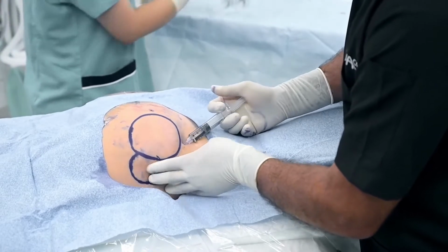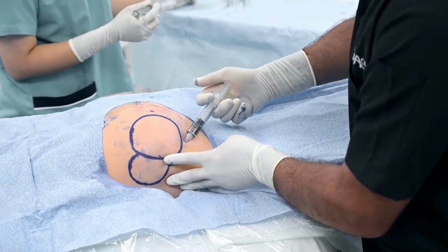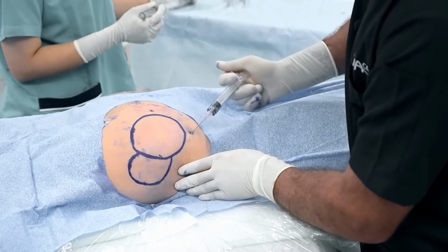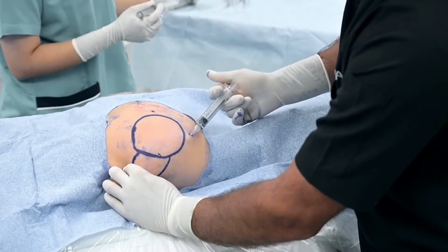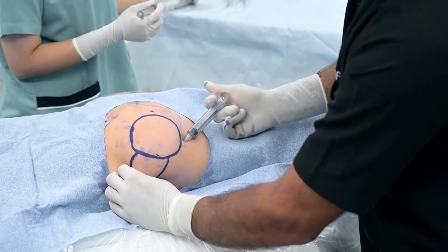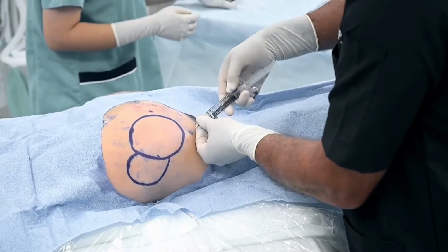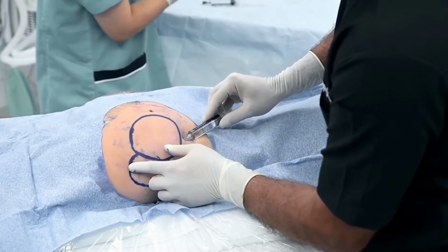This is a little bit more the hip dips. This here is the lateral butt. She has an asymmetrical defect. So first of all, this injection is deep. So now the tip of my cannula is here.